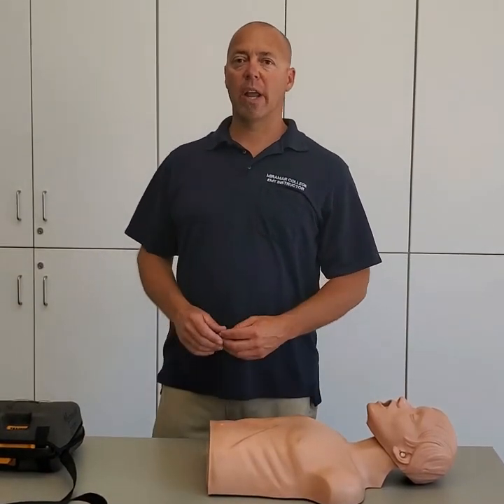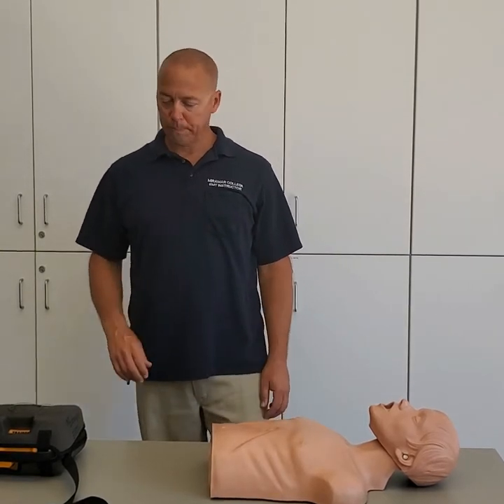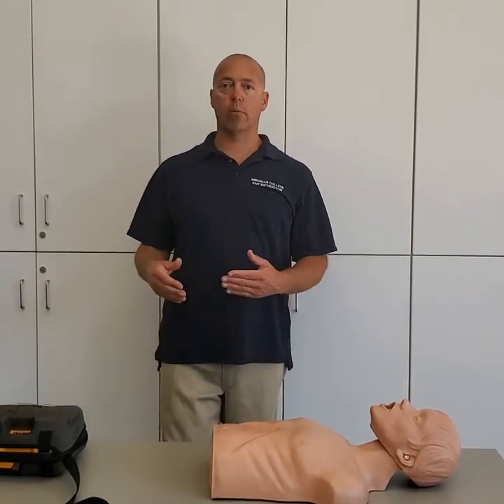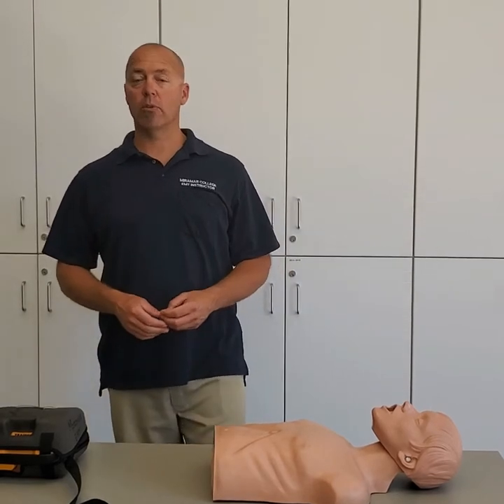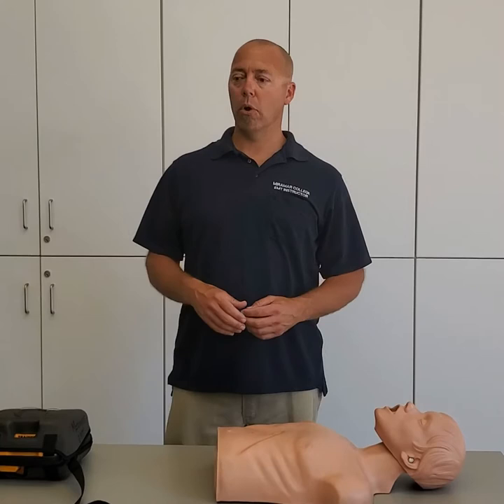This is the second part of our AED video. I wanted to run through how to apply this. When you bring the AED on scene, we want to use it as soon as it becomes available — as soon as it gets here, open it up and deploy it.